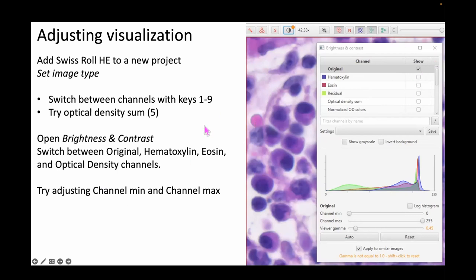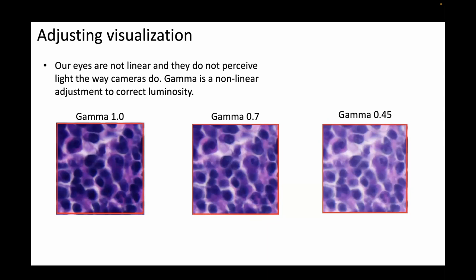Get familiar enough to understand that pressing a key on the keyboard switches the channel, and have a brief look at what those channels are. One of the most beautiful things I saw early on in QuPath is that when you open an H&E image, it automatically separates the hematoxylin and eosin stains — it does some guesswork, and you can improve that if you choose. I'd also like to point your attention to viewer gamma. Gamma is a non-linear adjustment of the display; it does not change the data, but it can help you immensely when working with brightfield images.